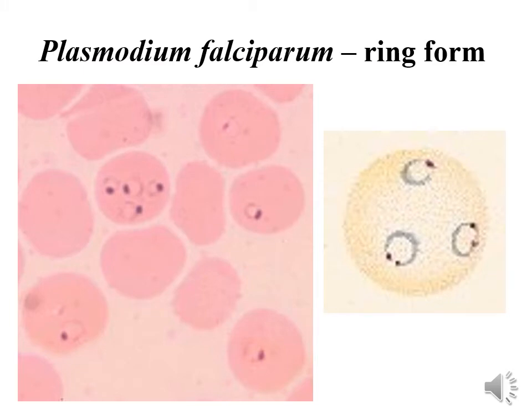This is now some slides to show you the parasite which you have recovered in the earlier lectures. So these are to show ring forms of Plasmodium falciparum causing the malignant type of malaria. Of course, for an expert person, he can identify the characteristics which are more typical for falciparum. For example, if you find a couple of parasites in a red blood cell, this is suggestive of an infection with falciparum.